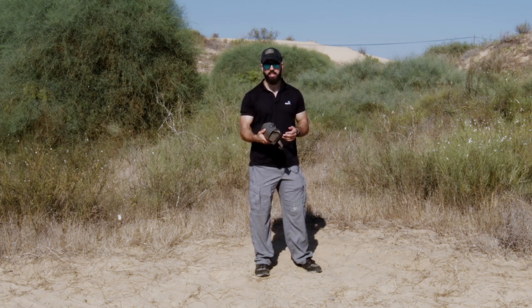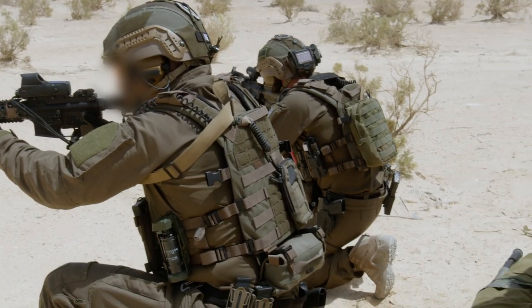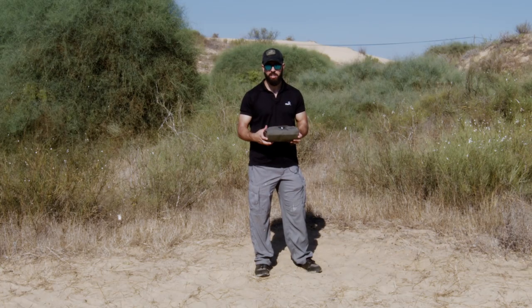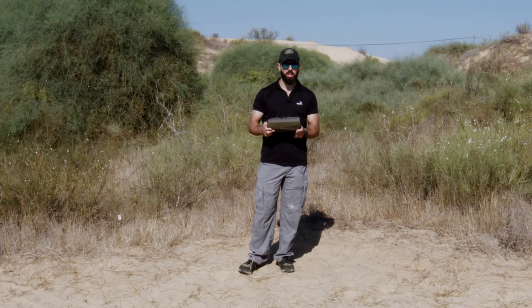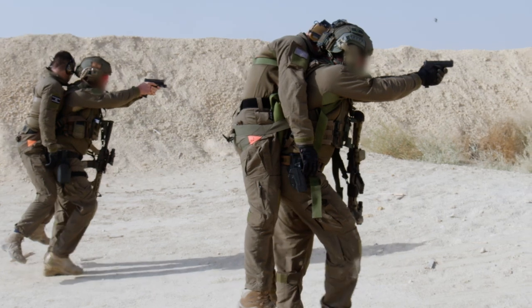Let me talk about why you'd want something like this. In a lot of situations, you have small units operating behind enemy lines who don't have the ability to carry more than just a few injured people, because it takes four people — four corners — to carry a stretcher. And if you're relying on fireman's carry to evacuate wounded people, that's not very sustainable for longer movements and is extremely uncomfortable both for the injured person and the person carrying them. This is an intermediate solution, better than fireman's carry, because it lets you keep your hands on your weapon and be more upright and more aware of your surroundings.